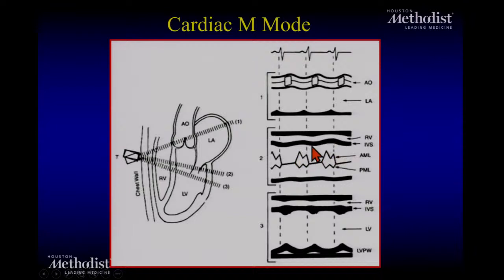That is ideally, this should be thickening a little more. Whoever renders it, it's not pure and good. The mitral valve, if you see the anterior and the posterior leaflet, it has almost like an M and a reverse M because that's what's happening to the mitral valve. Diastasis, during diastasis, then with an atrial kick, it opens up again, and then it closes, okay?